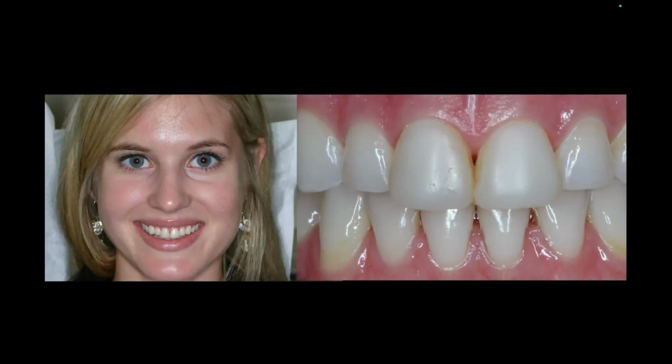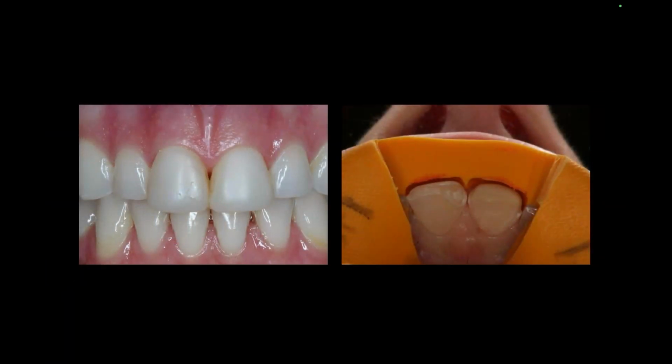So in the end, it's all about managing space, right? And I don't care if the case is a newer case like Jessica's case I just showed you, or an older case like this where I actually used more of the original lithium disilicate materials. My goal is the same. If I have 3/4 of a millimeter or a millimeter of space, I have to figure out which is the right material to use, whether it's powders, how much opacity, how much translucency, or whether it's lithium disilicates. What ingot selection do I use? Do I use the same one for different teeth? And I'm going to say most of the time the answer should be no.